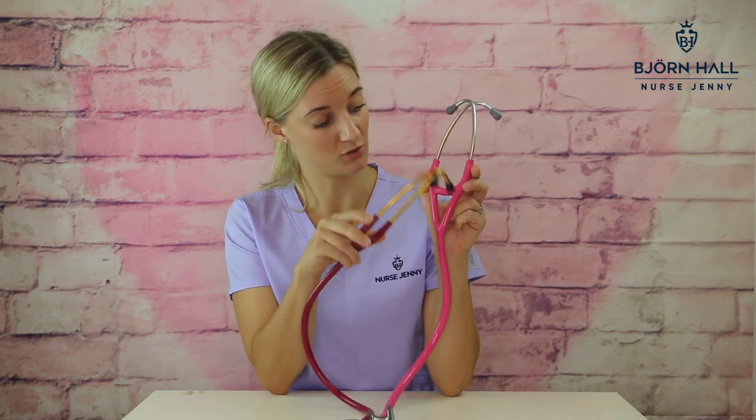Acoustics. In my detailed review that I've done on both of these stethoscopes, the Classic 3 got four out of five stars, and the Cardiology 4 received five out of five stars. So they're both really good acoustics. The reason the Cardiology 4 got five is it's got dual lumen tubing, which is great for acoustics. The Classic 3 has got single lumen tubing.